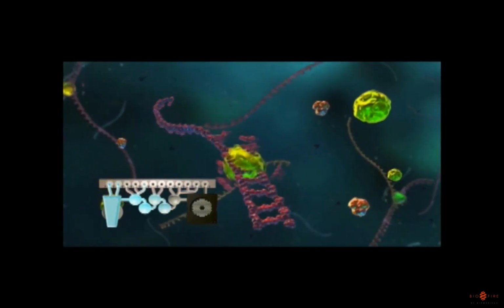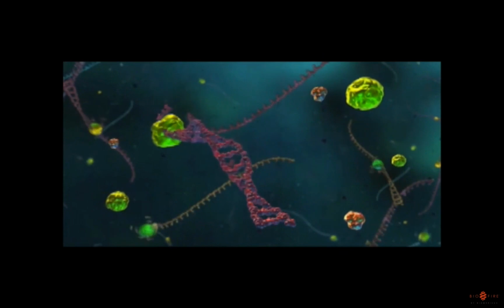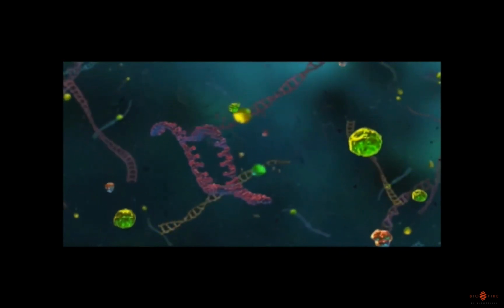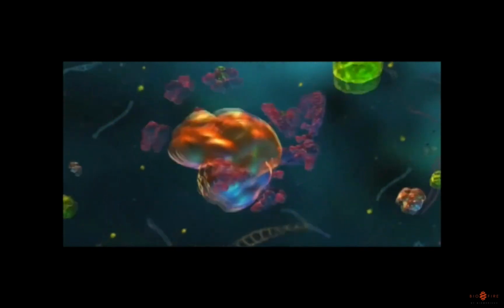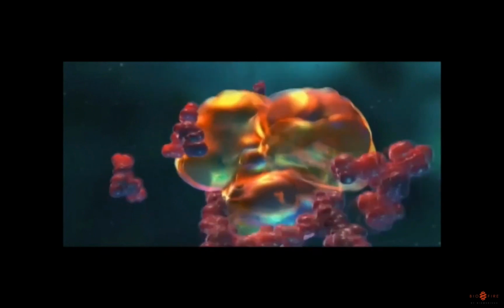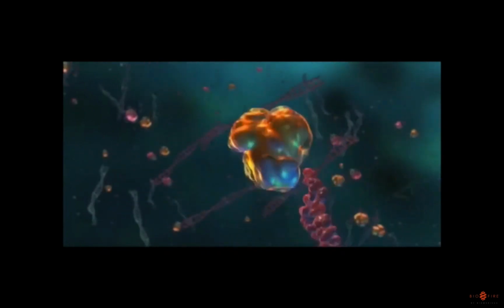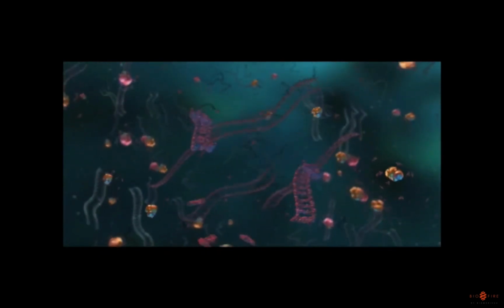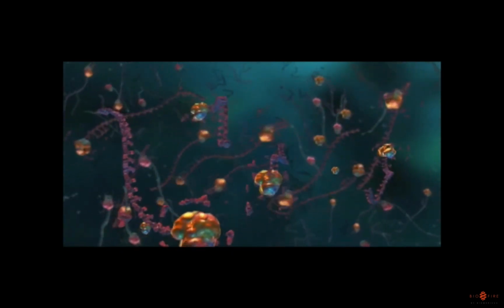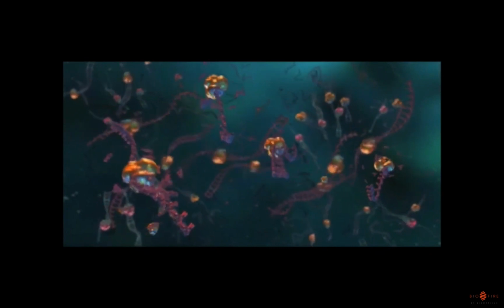A reverse transcription step is performed to convert any target RNA into DNA. This is followed by a high-order multiplex PCR involving dozens of primer pairs. During this first stage PCR, many reactions simultaneously occur in this single large volume reaction.